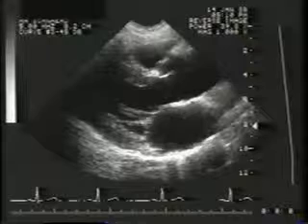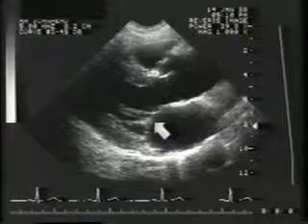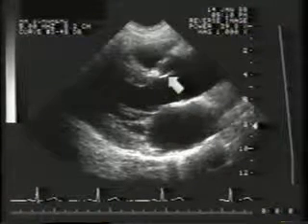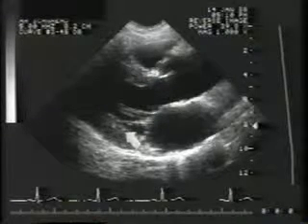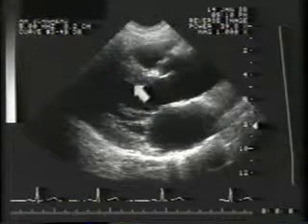This is a systolic still frame. The mitral leaflets have moved to a closed position and the aortic cusps are opened. Note that the septum and posterior wall have thickened, thereby reducing the size of the left ventricular cavity.